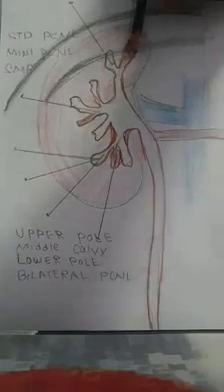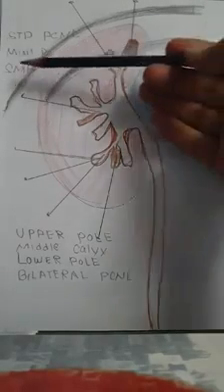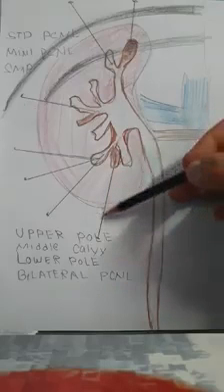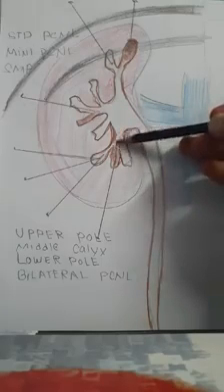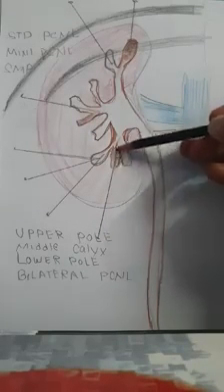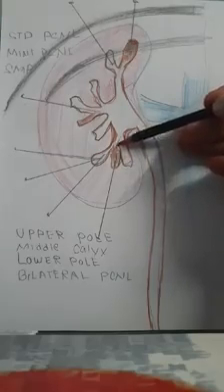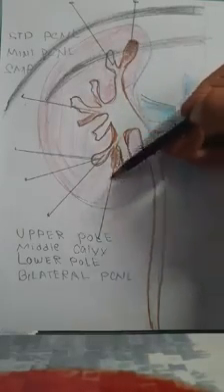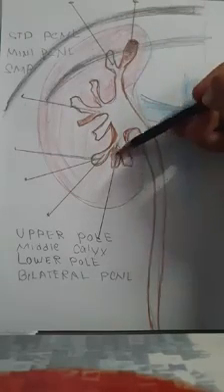But sometimes I also do inferior pole puncture. I only choose my inferior puncture when I'm doing my super mini PCNL. In this super mini PCNL, my concern is, let's suppose there is a stone here, only this part, I go up to here, I dilate up to here, and I use my laser, because using the laser, there is no retropulsion of the stones. Otherwise, if I use my mini PCNL and I use a pump to have the effect of bringing the stone down, to evacuate the stones, the tendency is that the stone might migrate all the way up to here, sometimes up to here, and most of the time they also migrate up here, because we are using water force in the mini PCNL. So by doing that, it's very difficult. If they still migrate here, I have to put in another puncture here, because I cannot reach from here all the way here. It's sometimes difficult.